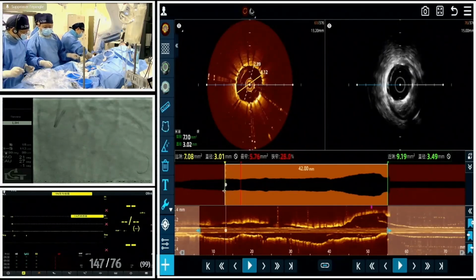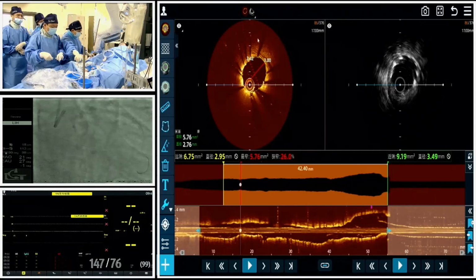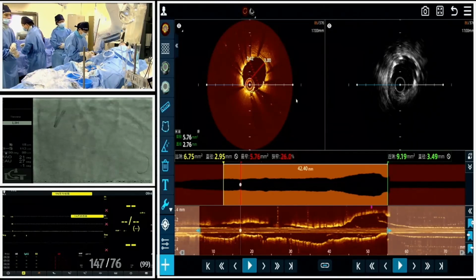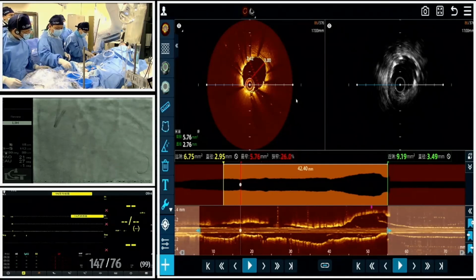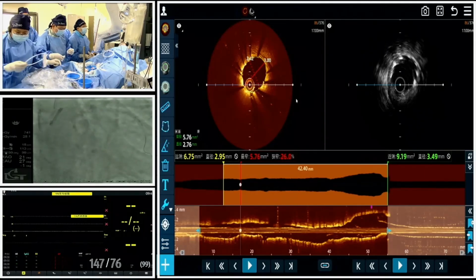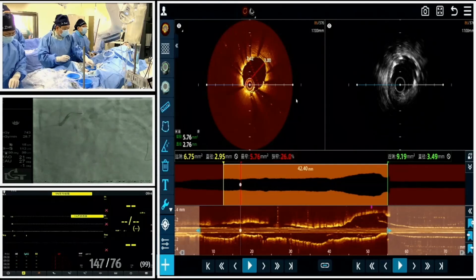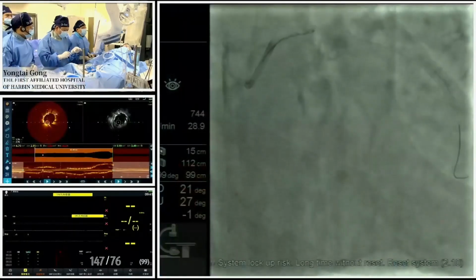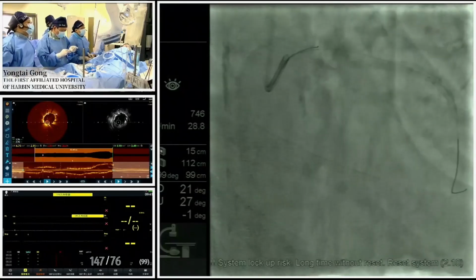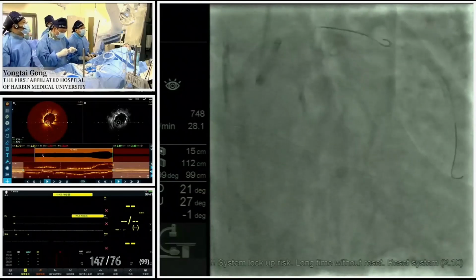So that is the advantage of the integrated system. Just based on the IVUS check, we could not get so much information. Okay, after performing the POT technique, next step we'll rewire the circumflex and then perform the kissing balloon technique. So this procedure is necessary after POT.